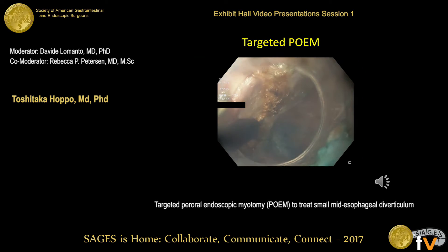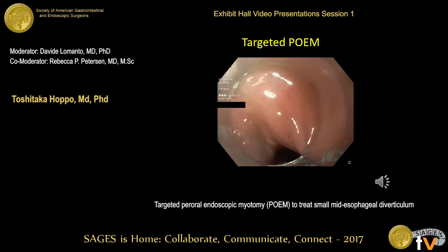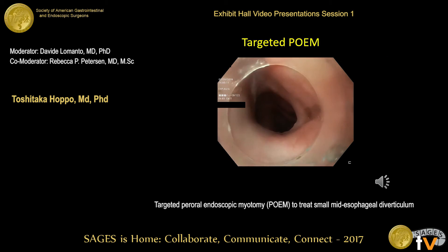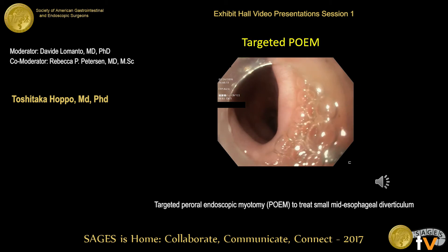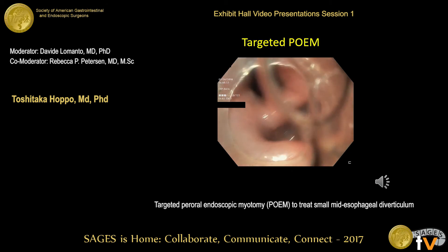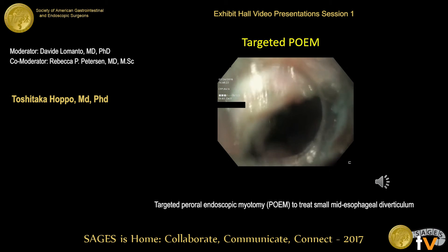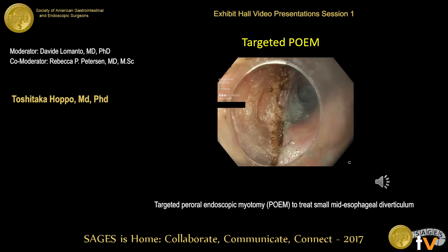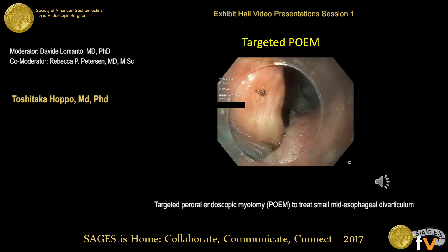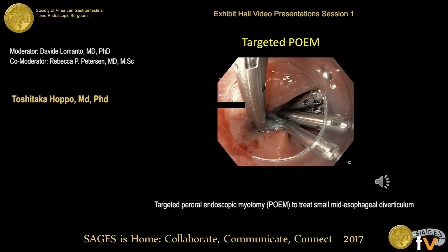This is the bronchus here. At the completion of myotomy, as you can see, the esophageal lumen became completely atonic, and I didn't feel any more popping sensation. To show once again: this is the submucosal tunnel, and the bronchus is here. The muscle band was completely divided, and the myotomy was extended two centimeters distally.